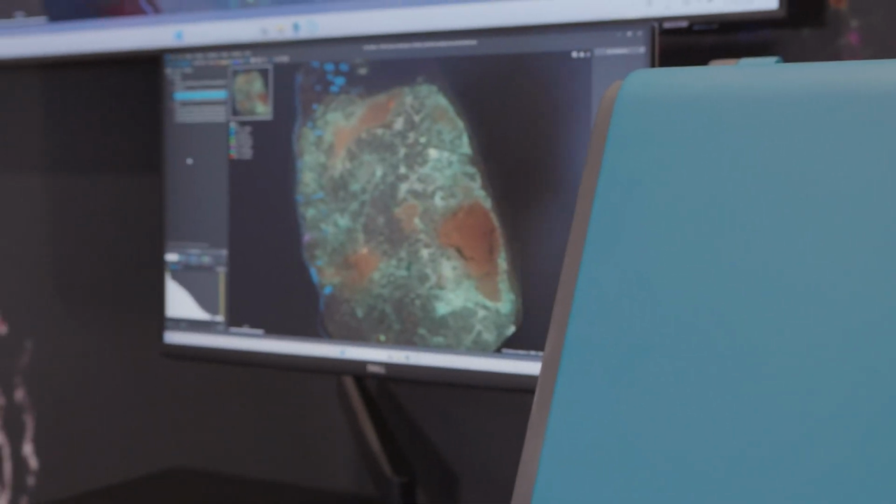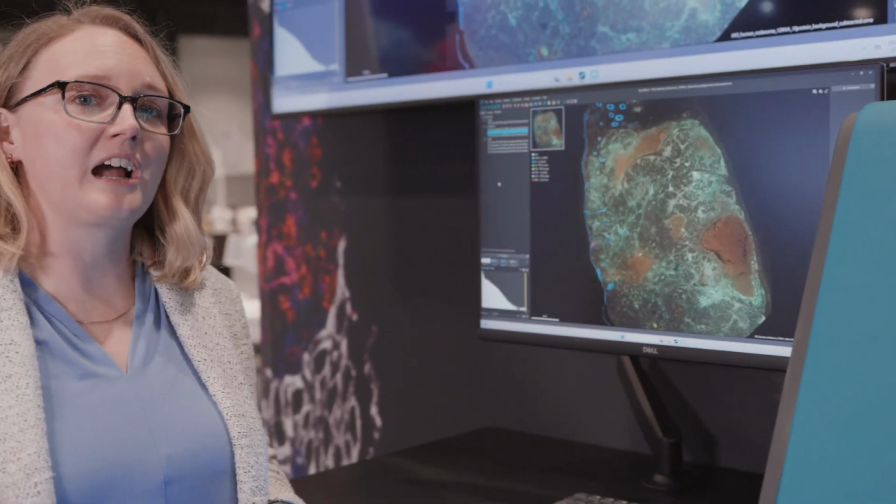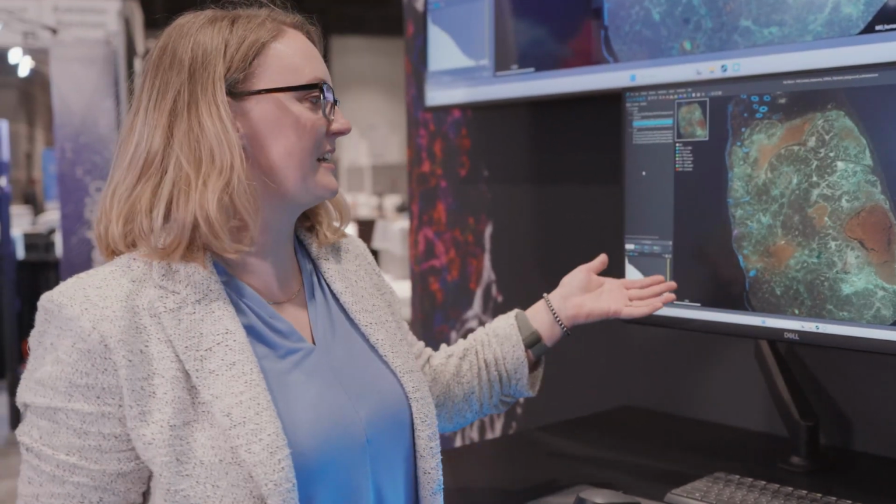When the COMET run is complete, you're going to come back to one OME TIFF file for each of the slides that you loaded, where you can do image analysis in our Horizon data analysis software.